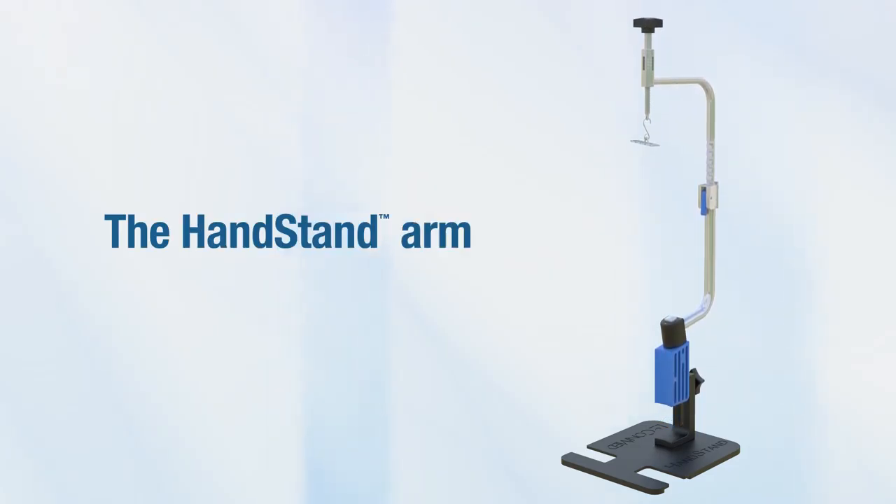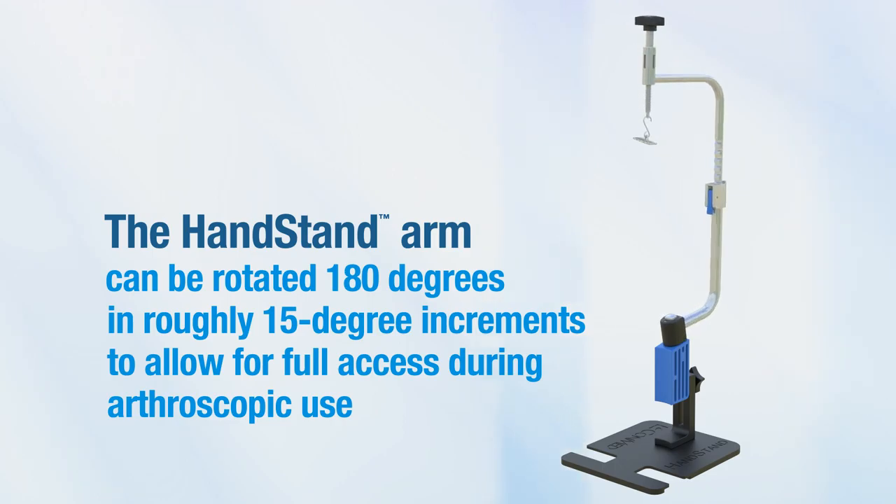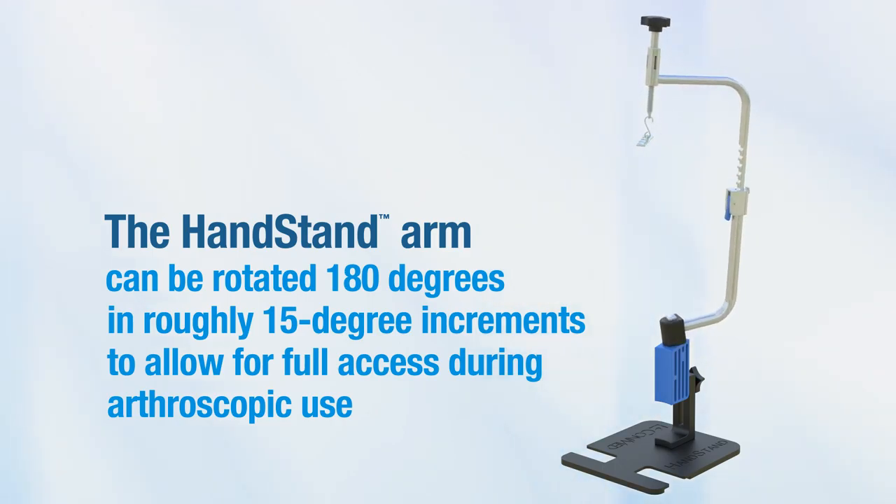The Handstand Arm can be rotated 180 degrees in roughly 15-degree increments to allow for full access during arthroscopic use.